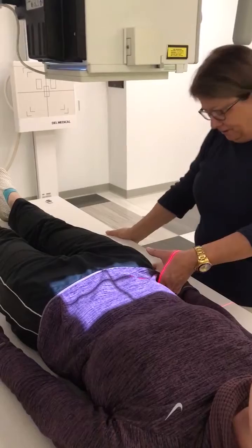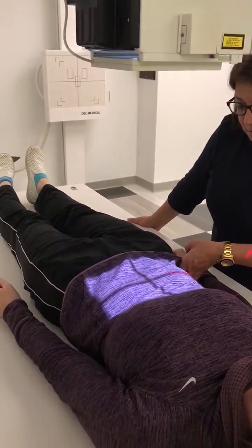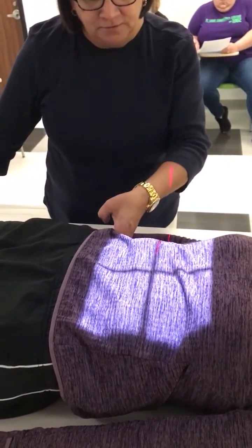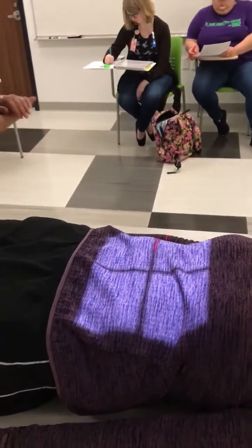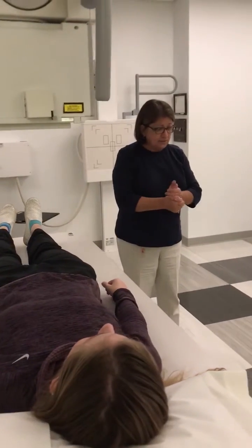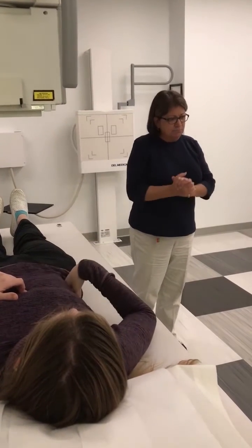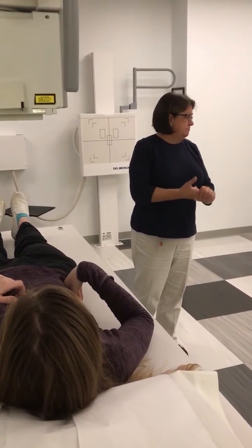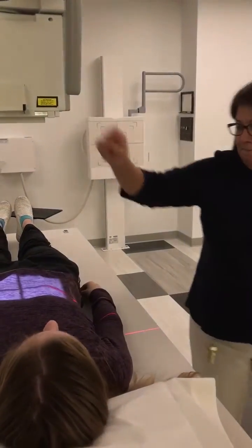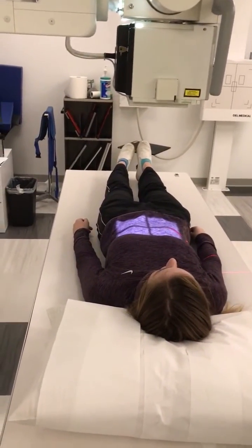Okay, I'm palpating again for the crest. And I'm going to center so that the bottom of the light is at the top of the crest. Now, again, as your book states, the centering technically is midway between the xiphoid process and the iliac crest. And we're using this method of centering so that the xiphoid process doesn't need to be palpated. And I'm centering in midline.